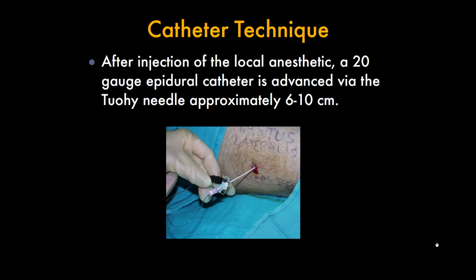Some Mastisol, coil it, Steri-Strips. It'll be there for as long as you want it. But you can use Exparel now for popliteal. Exparel is FDA approved for popliteal.